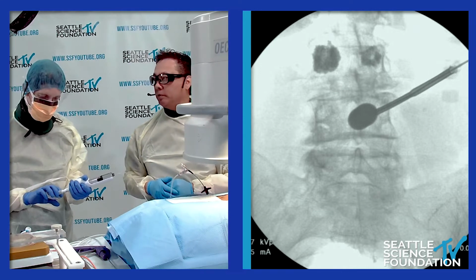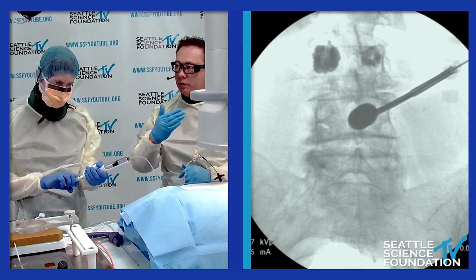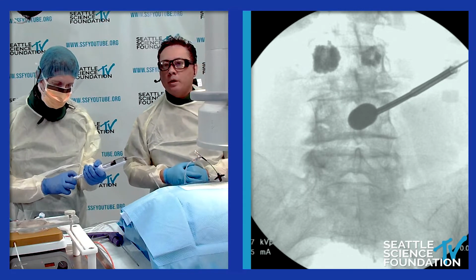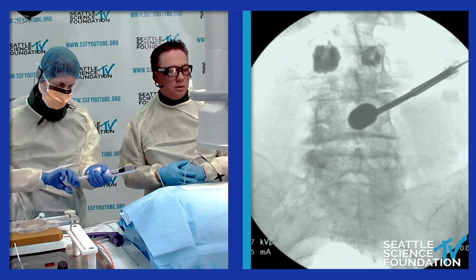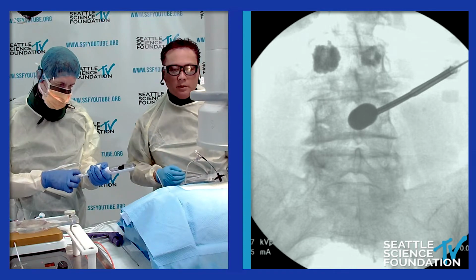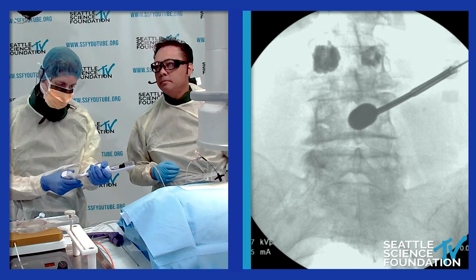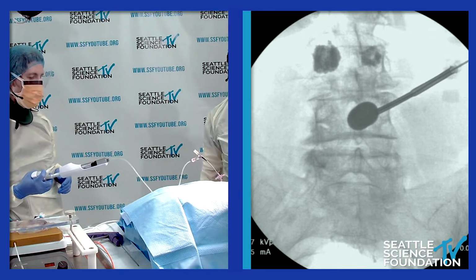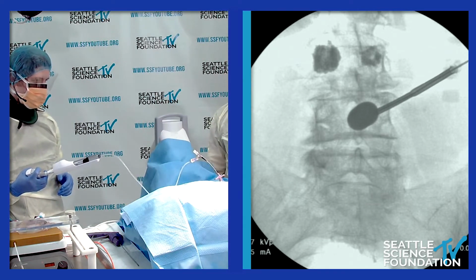with further inflation of the balloon. Of course, being careful inflating under a lateral view, but also checking the AP, staying away from the end plates as well. Go a little bit more. Let's take a shot. Let's check the lateral. Where is the cement? Cement's ready to go.